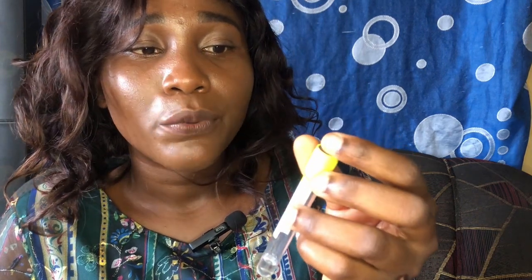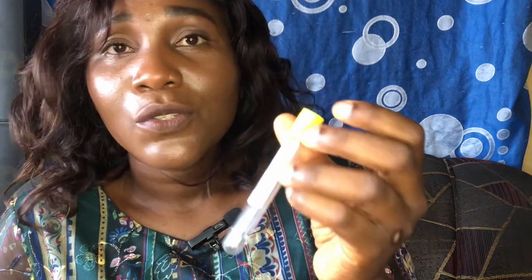You either call it a yellow top tube or a gold top tube. If you check inside, it has a gel, also used in chemistry. It's called a serum separator tube. Once you add your blood sample to it and leave it to stand, you would get your serum.